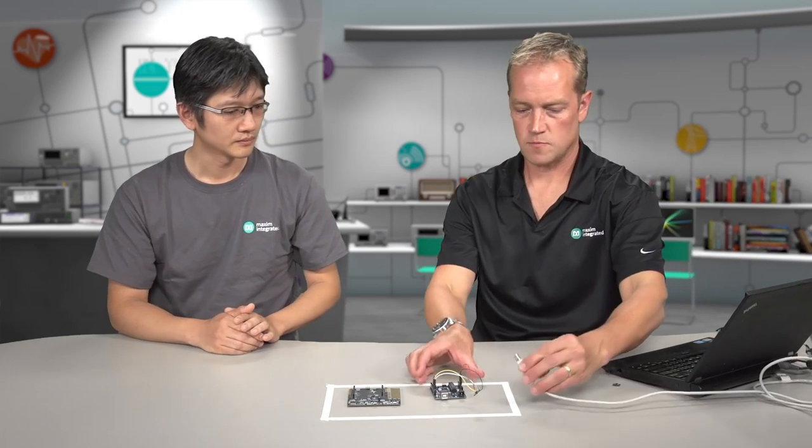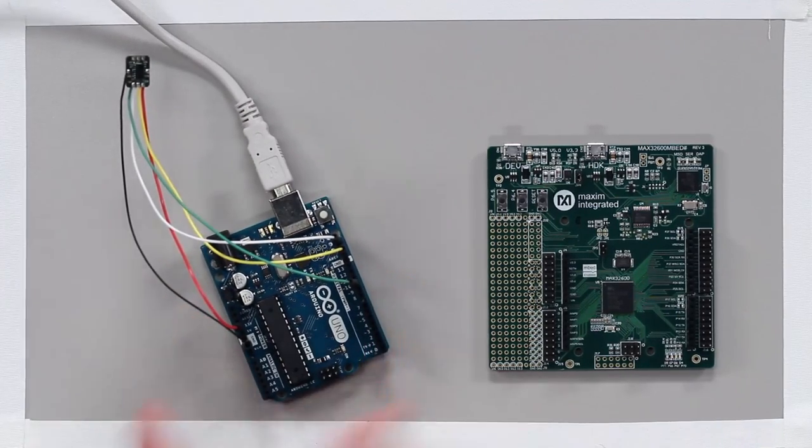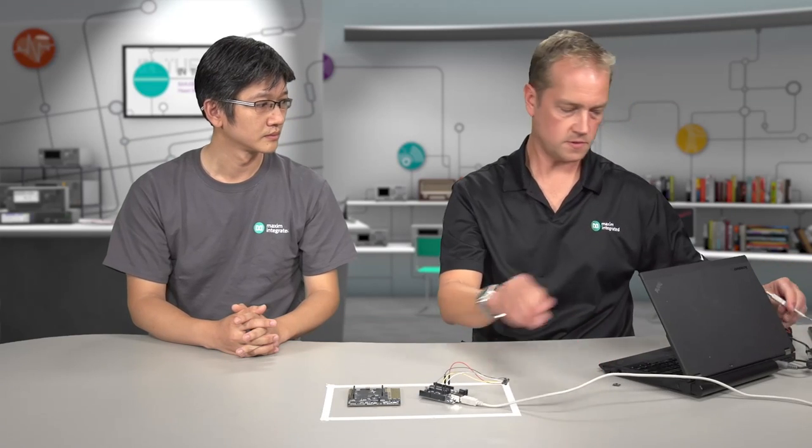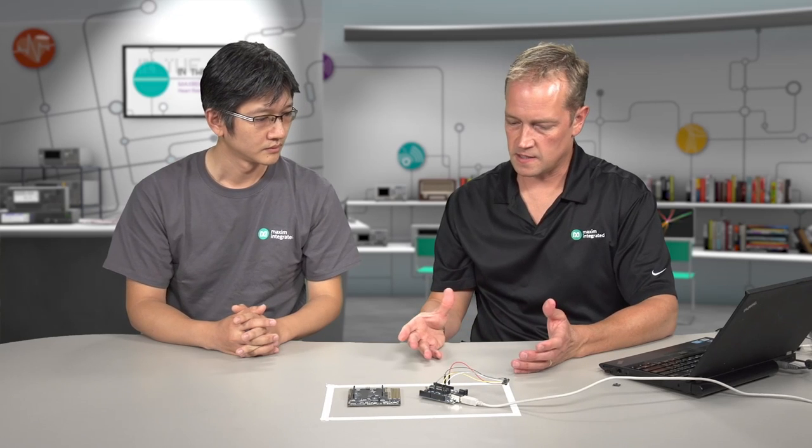Sound good? Sure. So we've got our USB Type B cable that will connect up here, and I will connect it to my computer. And then we'll go ahead and get out the source code for this. When you're looking at the MaxRefDes117 on our website, go to the Design Resources tab, and there should be a link on there to GitHub. We put the Arduino code on GitHub, so you can access it there. It's really easy. I think that's pretty much how people like to access their code, right? Right, nowadays, yes.